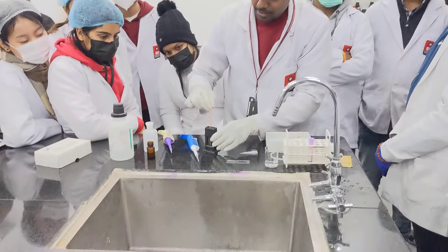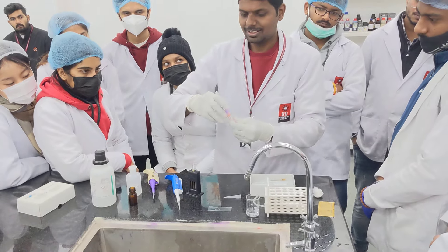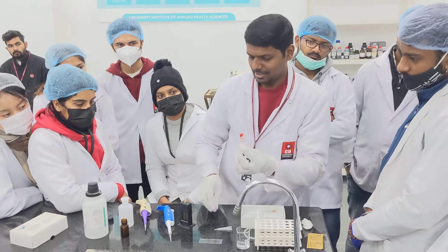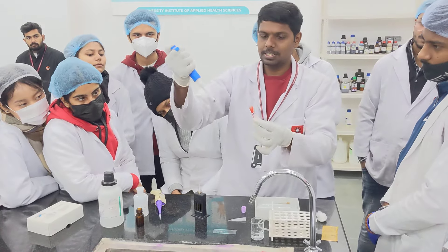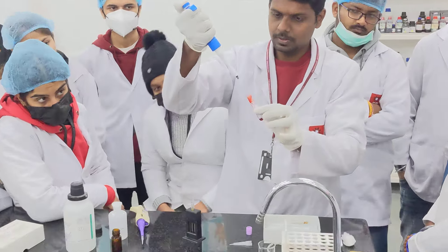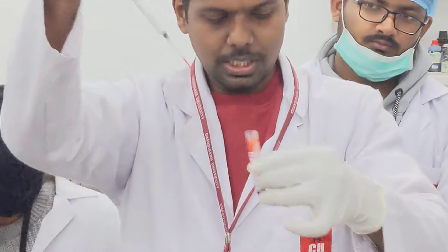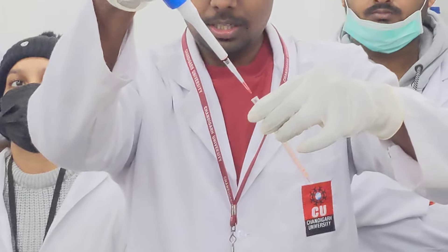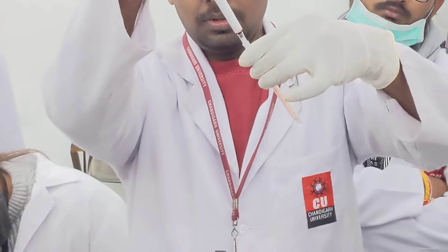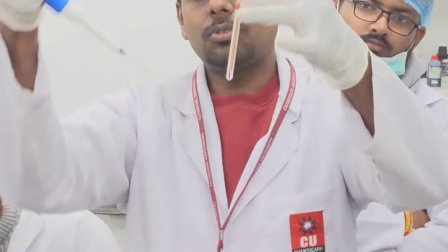The next step is to add blood — 20 microliters of blood. I am taking freshly collected EDTA blood. We are taking 20 microliters with the calibrated micro pipette. I have taken 20 microliters and we will add this into the HB tube. So I added 20 microliters; it is on the top now.